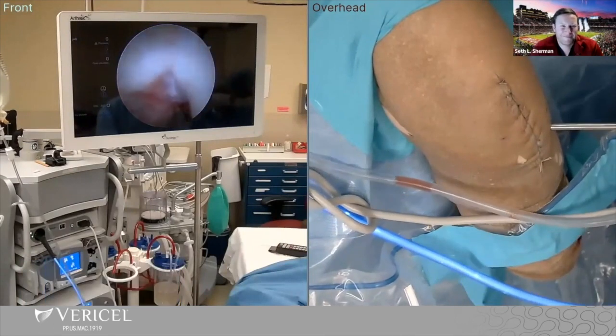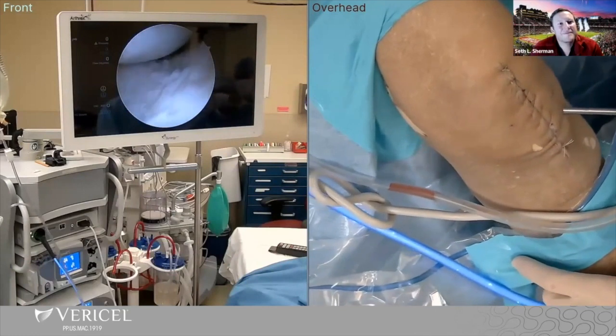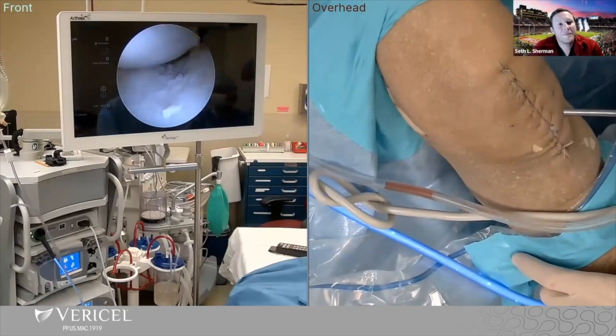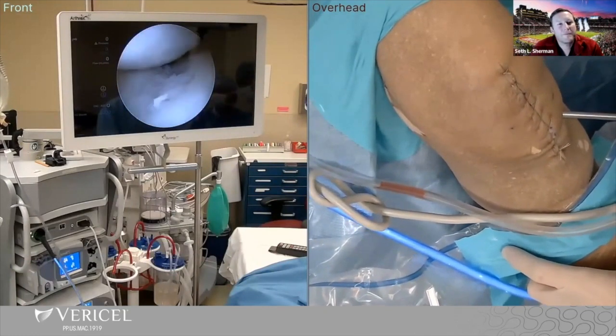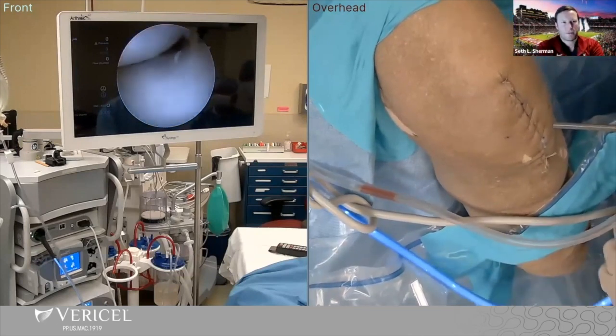So we did a lot of this prep ahead of time. You can see here, unfortunately, this person has a trochlear defect. The rest of the patella looks good — an isolated trochlear defect, good alignment. I'm just doing an isolated MACI on these.